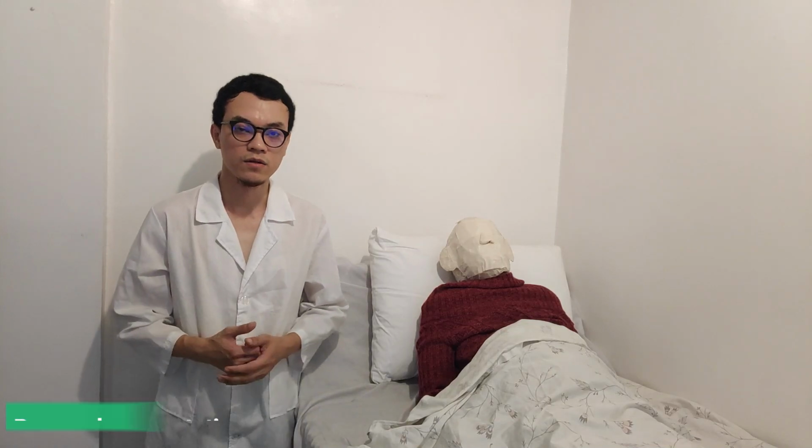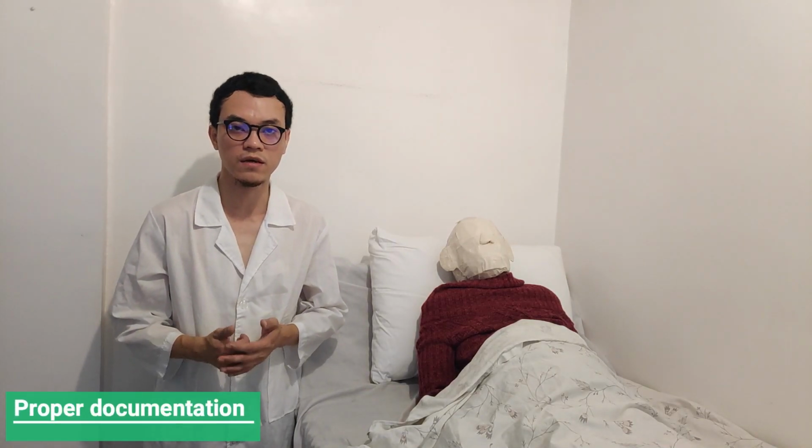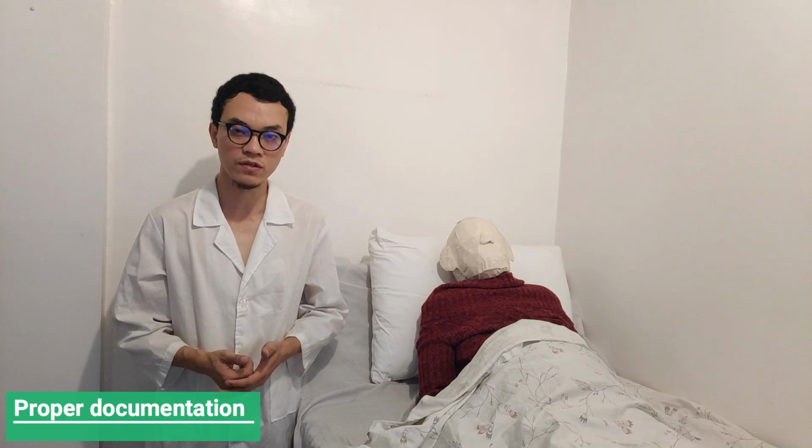And then lastly, don't forget to document the procedure, findings, and result, and don't forget to sign the medication administration record.